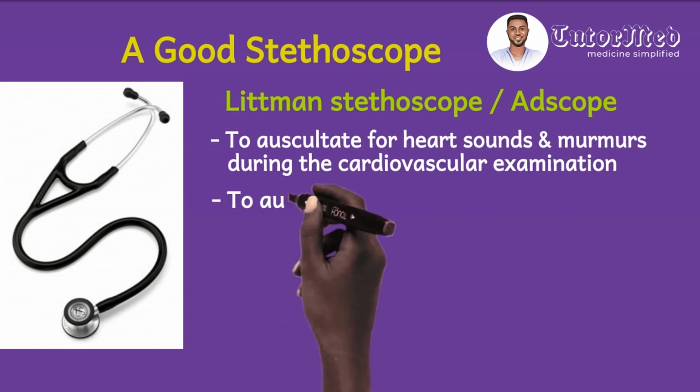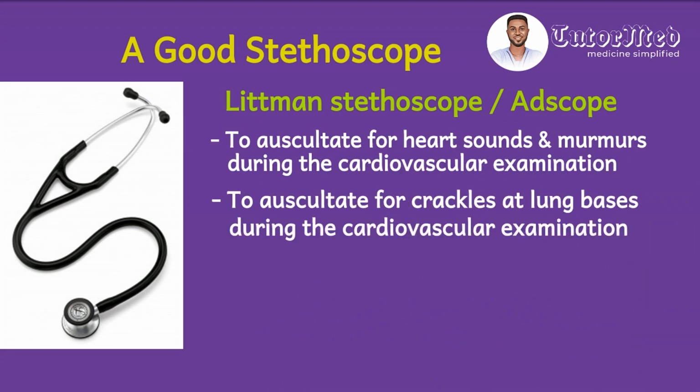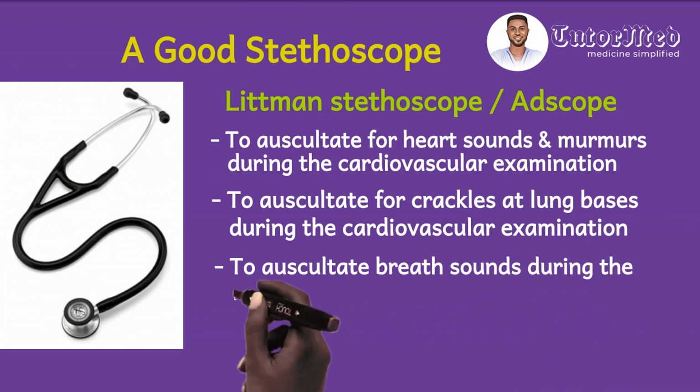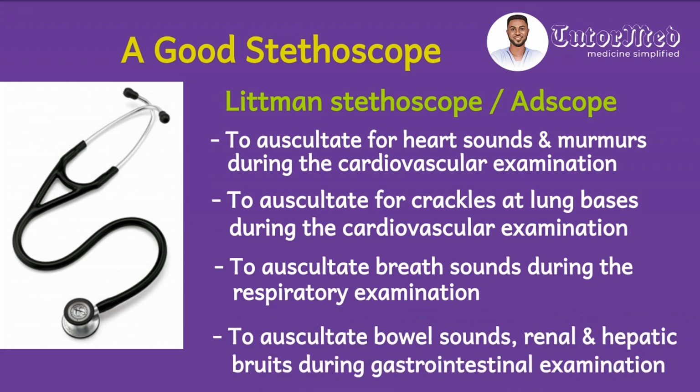You'd also need it to auscultate for fine crackles at the lung bases during the cardiovascular exam to prove that the patient has pulmonary edema. You would need this tool to auscultate breath sounds during the respiratory examination. Again, you will need it to auscultate bowel sounds, renal, and hepatic bruits during the gastrointestinal examination.